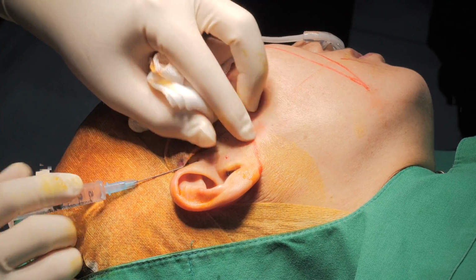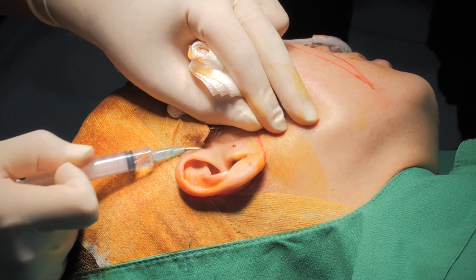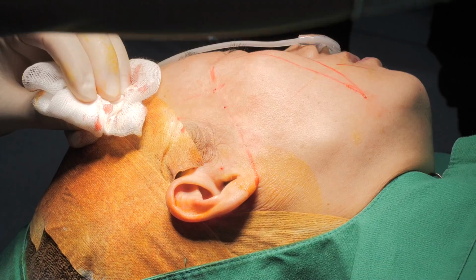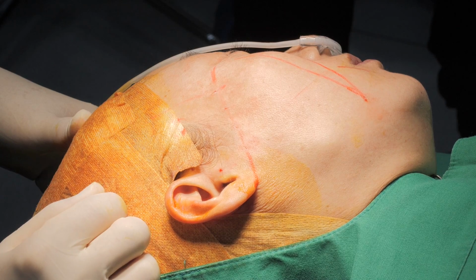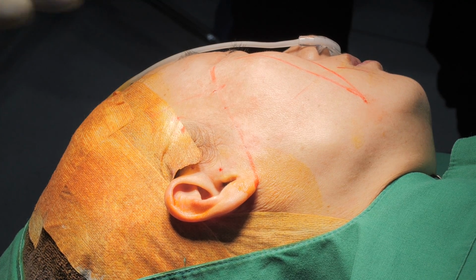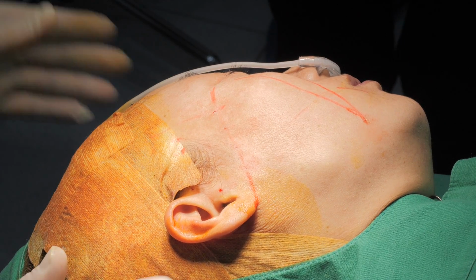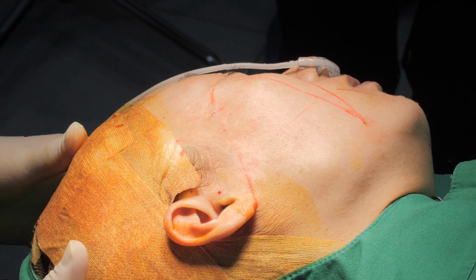At what plane are you going to be working today? A subcutaneous layer. Usually subcutaneous. But once you accumulate a lot of experience and you can deal with a lot of complications, you can approach under the SMAS layer. As I mentioned, there's a lot of important structures. Are you going to do anything under the SMAS today? Actually, I try to stay on the subcutaneous layer, above the SMAS. Yes, but I cannot control it. Sometimes it goes deeper, sometimes it goes slightly upper, so we cannot control it completely. Anyway, just try to keep above, as an intermediate position, for safety.